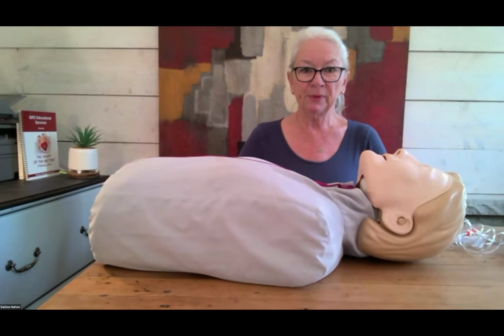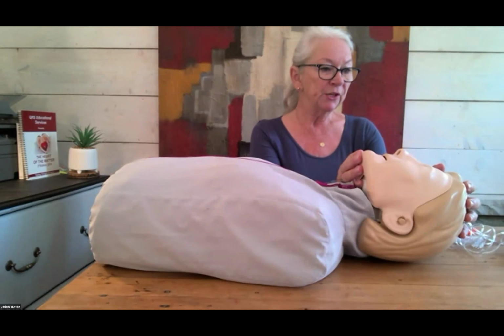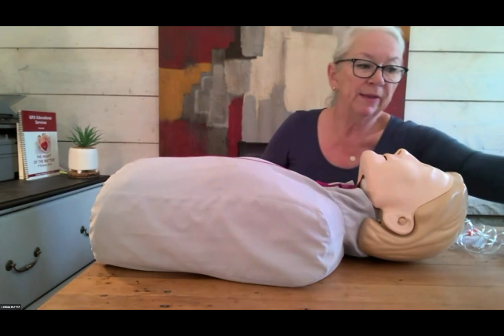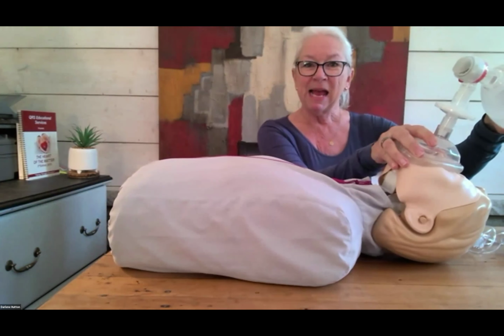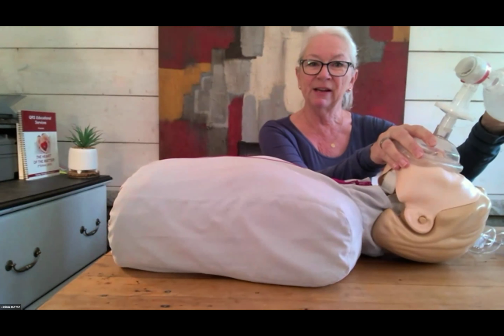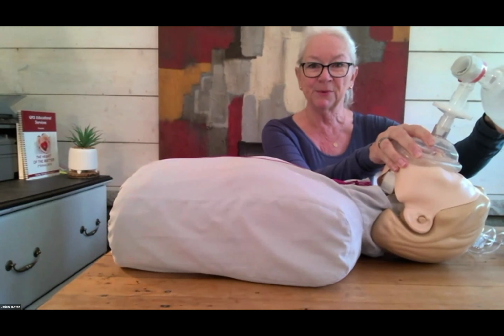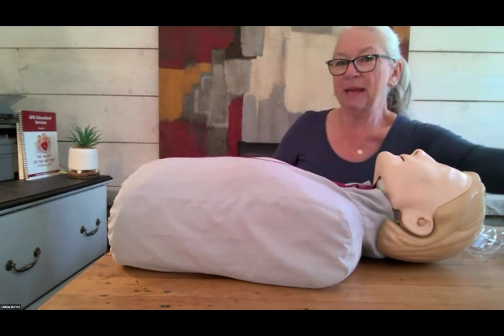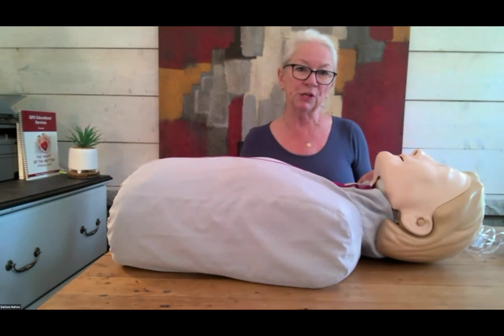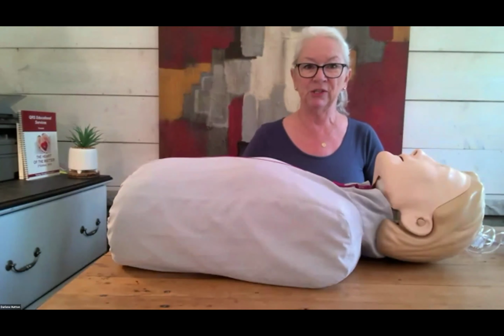Let's talk about the 3 Ps. The first is the patient. So when you're doing the airway with an oral airway and the bag valve mask, if you have dentures in and they are giving a good seal, they're well fitting, then by all means keep those dentures in. But when it comes time to preparing to intubate, if there are dentures or loose teeth, make sure that they get taken out before intubation is started.